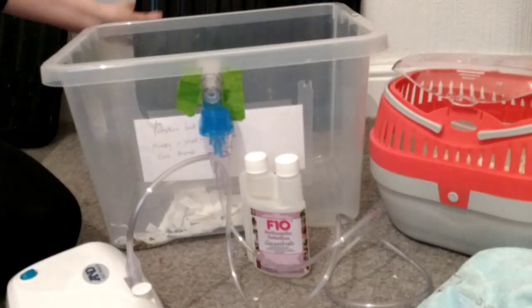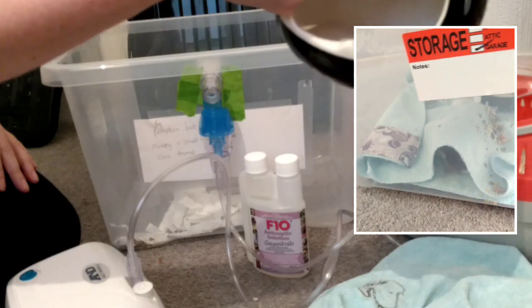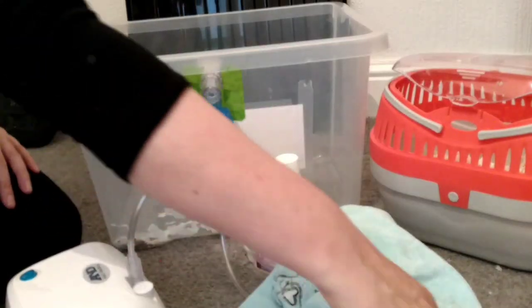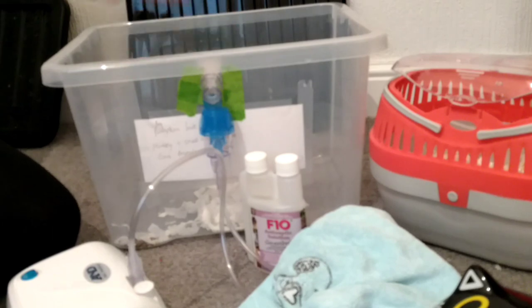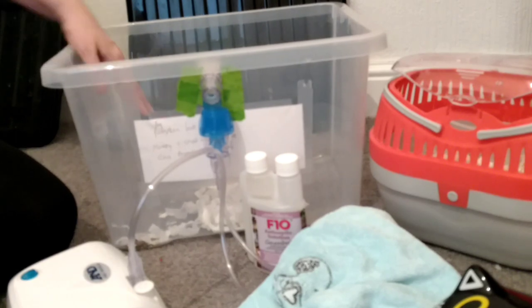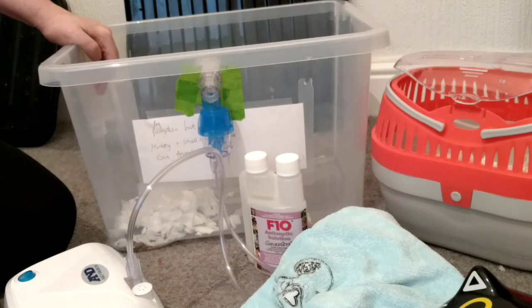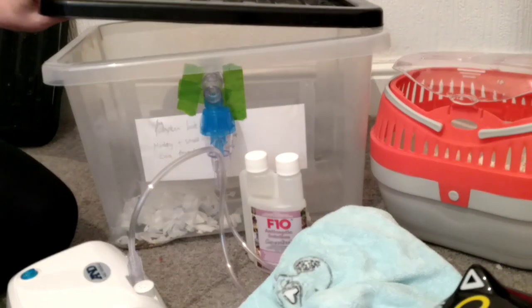Because I was worried about Moonbeam stressing out, I started by putting a little towel in the bottom, a little hide, and scattered a bit of food and bedding. But Moonbeam decided to try and tear it all up and pick the hide up! So I took that out. I did read online that you shouldn't use bedding or towels because they'll soak up the vapour, but I thought that had to be minimal. I'd rather Moonbeam not be so stressed being contained in the box.